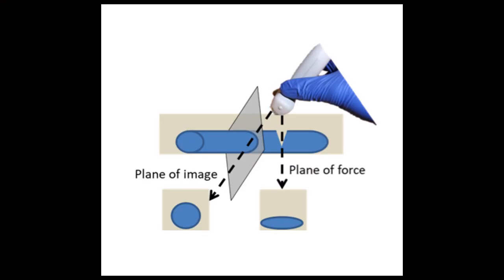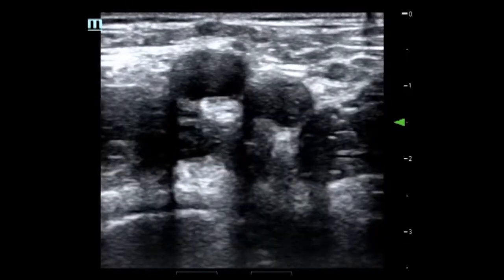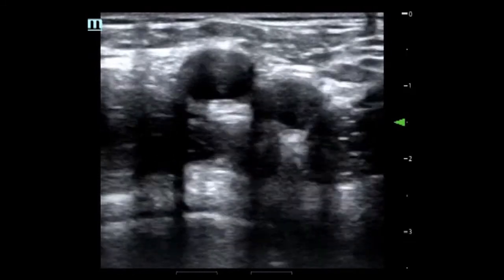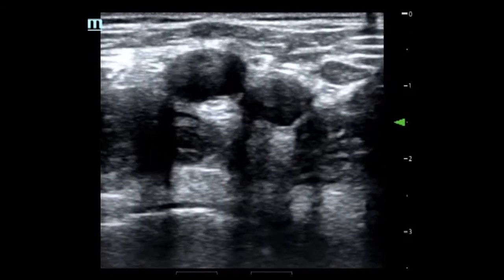It's important to apply pressure directly in the axis of your probe, because if you apply pressure straight down and your probe is pointed superiorly or inferiorly, you won't actually be visualizing the area you're applying pressure to, and it'll appear that the vein is not compressing. Here we see an example of compression off-axis: although the operator may be applying significant compression, the slice seen by the ultrasound is out of the plane of the pressure, and so the vein will not appear to completely collapse.